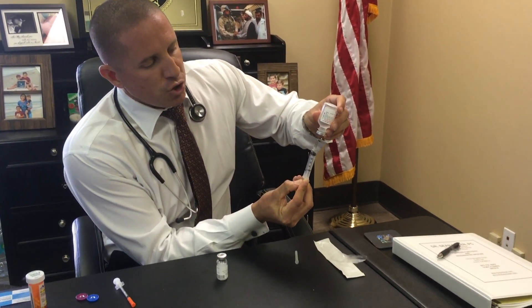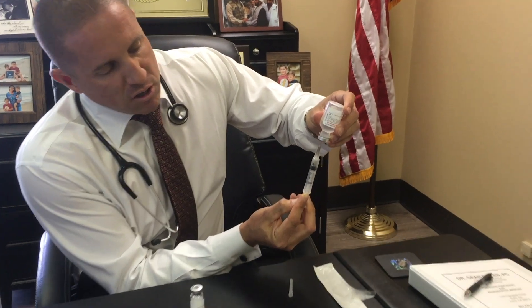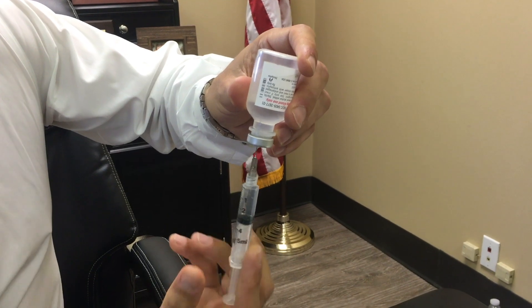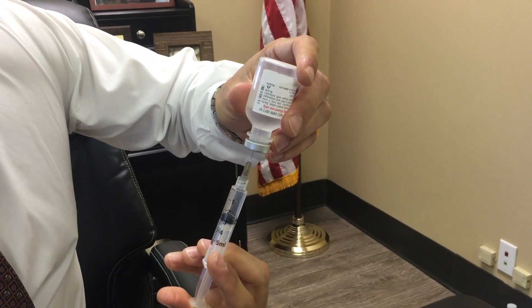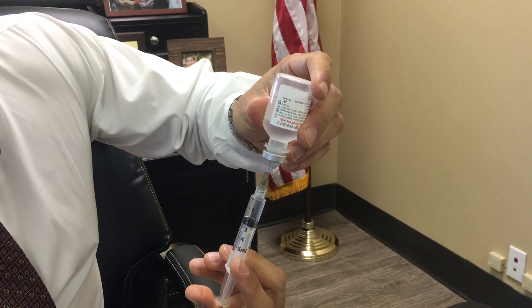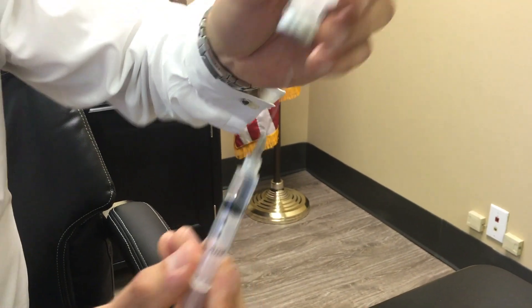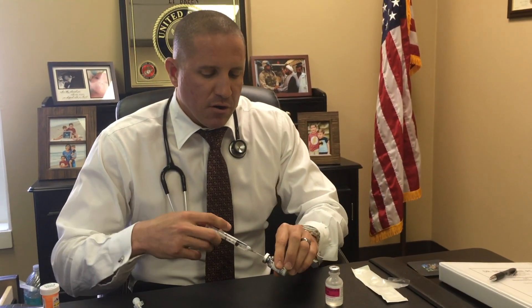You're going to pull out 2ml's. This is a 3ml syringe, so you pull past the number 2 and then push back down to right there, so you have exactly 2ml's of bacteriostatic water.